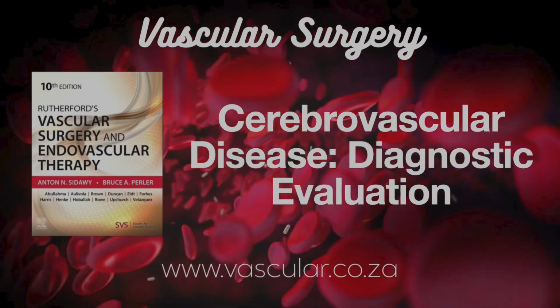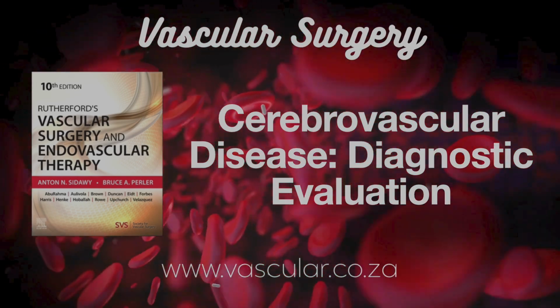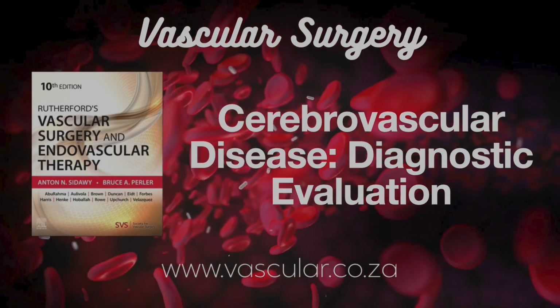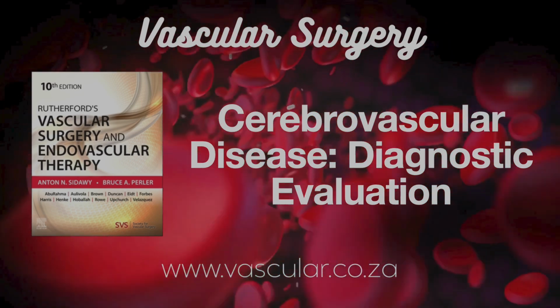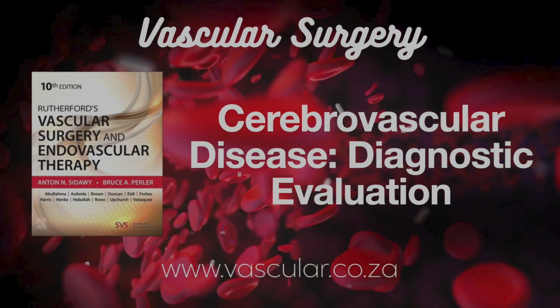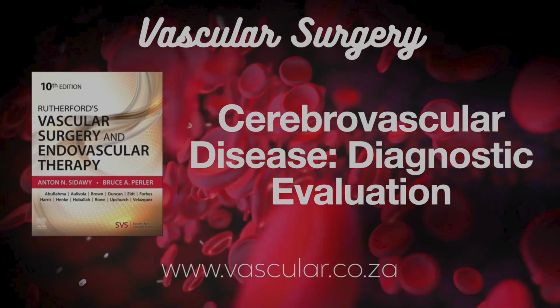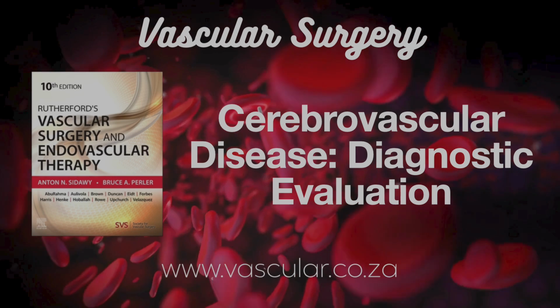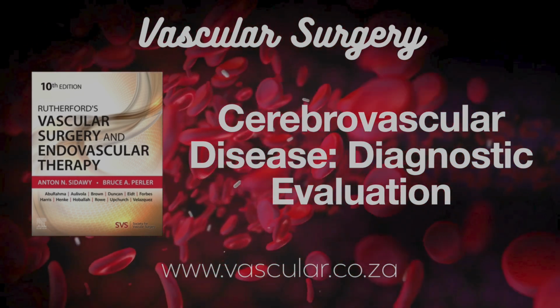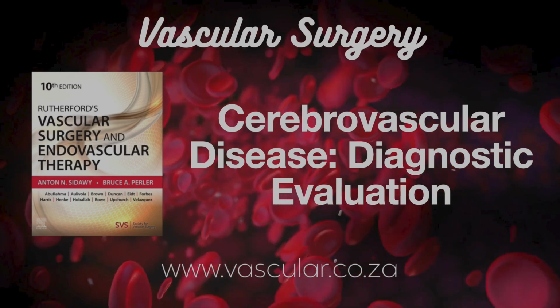Okay, to wrap this all up, what are the key takeaways from our discussion on diagnosing carotid disease? I think the main points are duplex ultrasound is definitely the first-line tool. It's non-invasive, accessible, and often gives us the answer. But it's not always enough. Right. CT, MRA, and occasionally DSA play crucial complementary roles when DU has limitations or when we need more anatomical detail, especially for procedural planning.